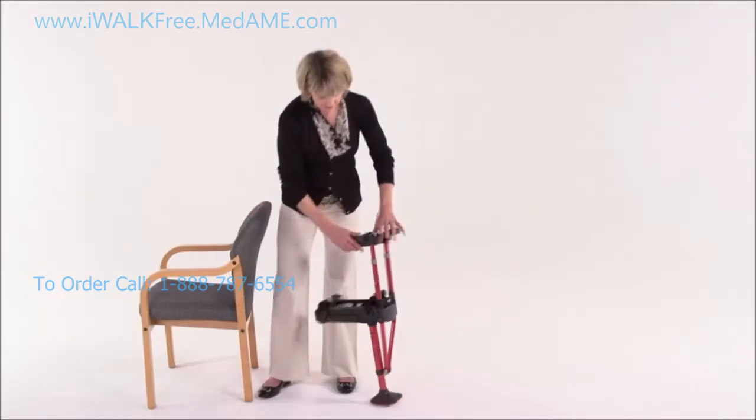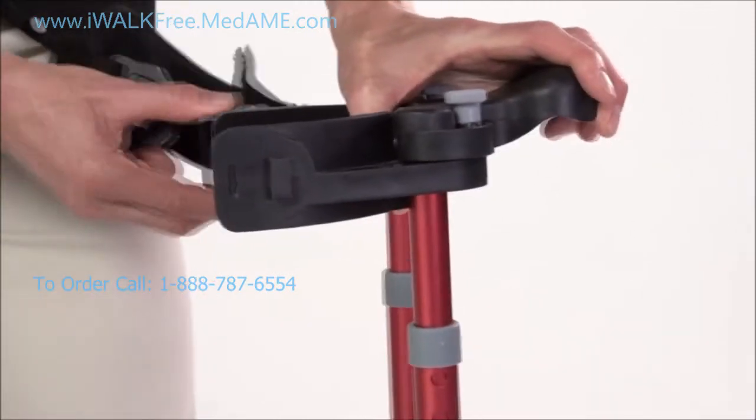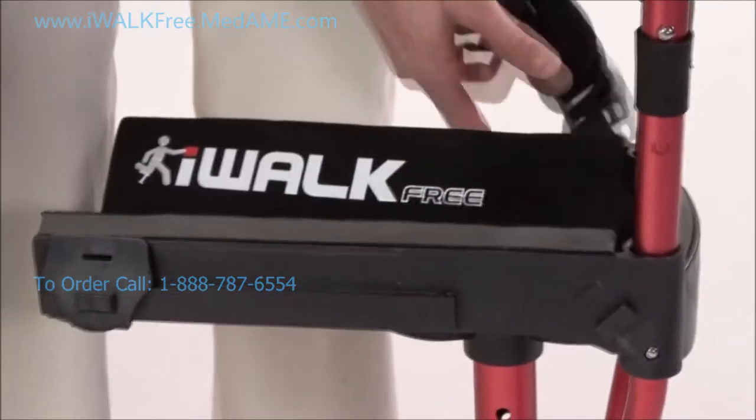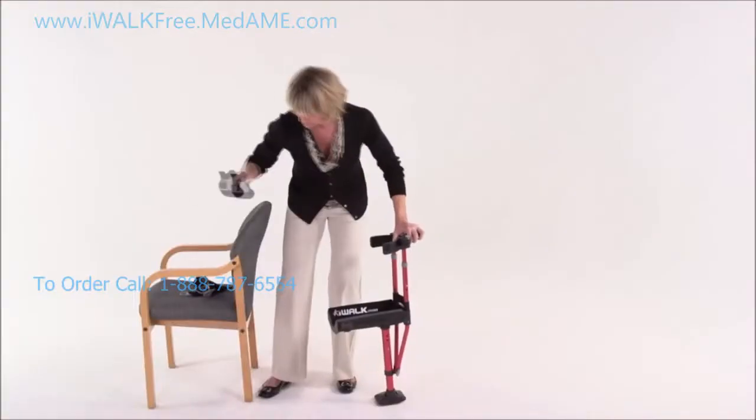We'll start with your iWalk fully assembled. Now let's remove all three of the straps. Simply push forward on the T-lock buckle and lift off. Put them aside for now.